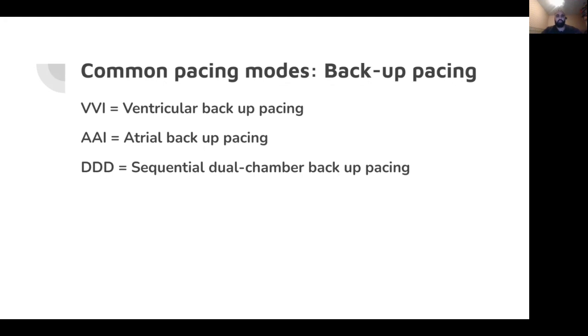Because that's how pacing works. You basically give a small electrical stimulus, and that prompts a depolarization. And so that's how ventricular backup pacing works.